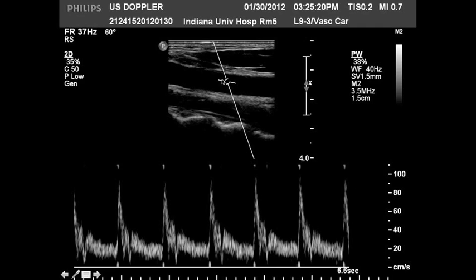The other thing is these two little whiskers on the side — those are your angle correction. You should always see the angle correction marks parallel to the flow, or parallel to the walls of the blood vessel if you can see them.